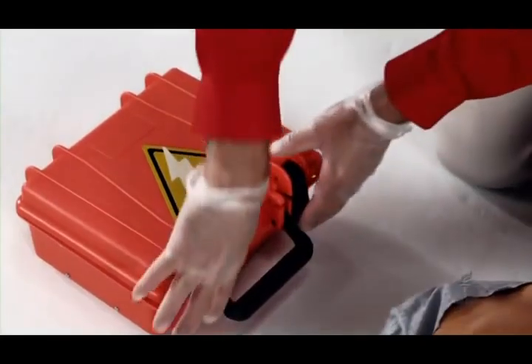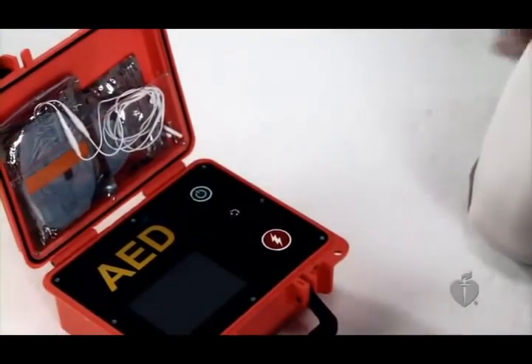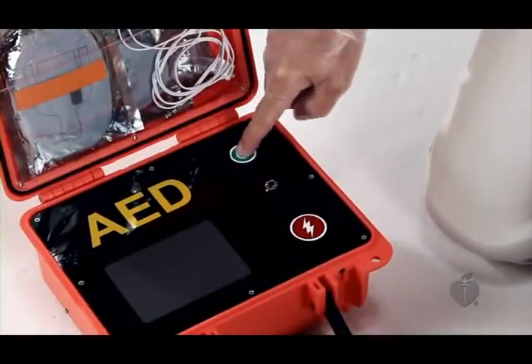Although AEDs may differ slightly, there are 4 universal steps for operating an AED. First, turn on the AED. Open the carrying case or the top of the AED, then turn the power on. Some devices will power on automatically when you open the lid. The AED will guide you, but it's still critically important that you know these steps.